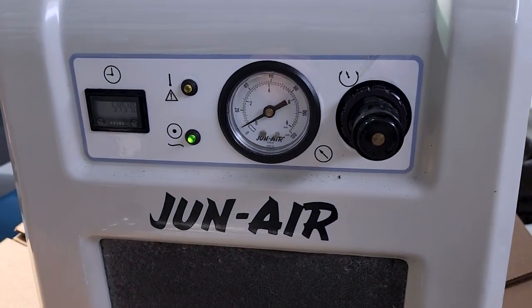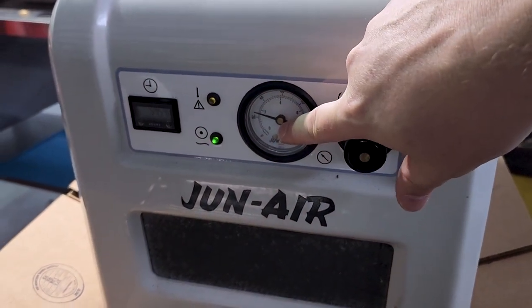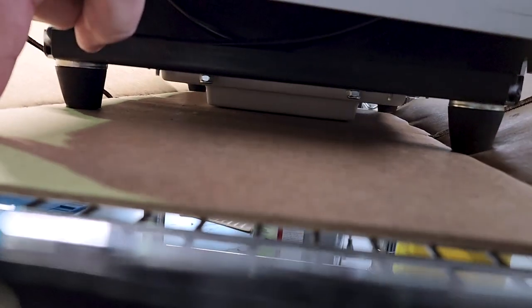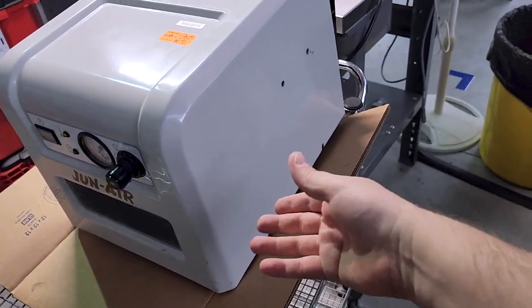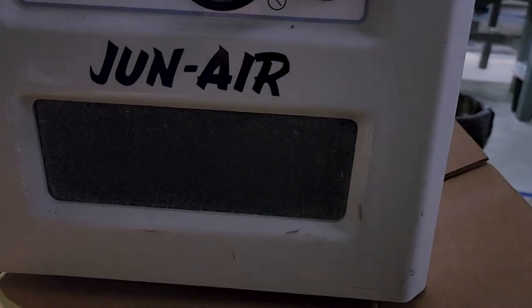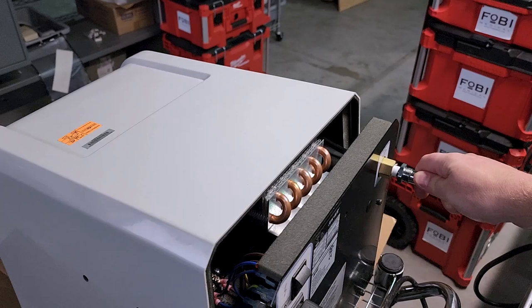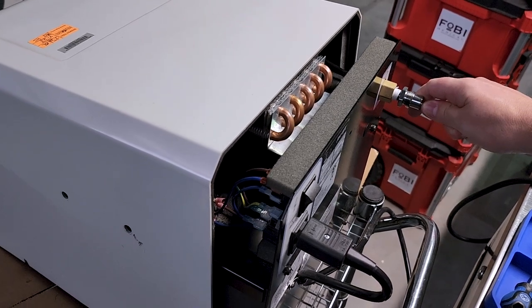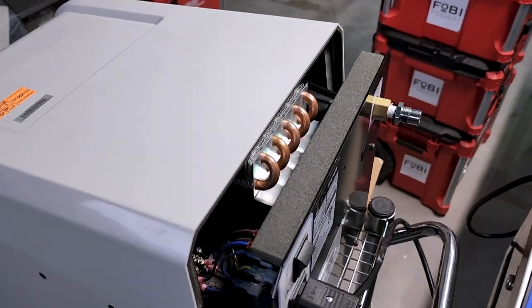See, we have power. This air light is indicating a problem. So you notice how it wasn't building pressure. It was venting internally to a drip pan, which is located underneath. You can see it down there. So it purges the moisture from the tank for a certain duration, and then it goes to that tank in the bottom, and then it starts building pressure. And it builds pressure quickly and quietly, which is its job. Let's go ahead and vent it. It's a small reservoir, so luckily it builds pressure and it removes pressure quickly. There we go. All right.